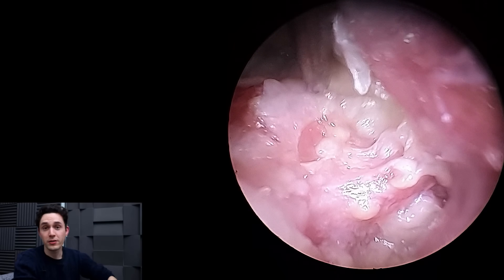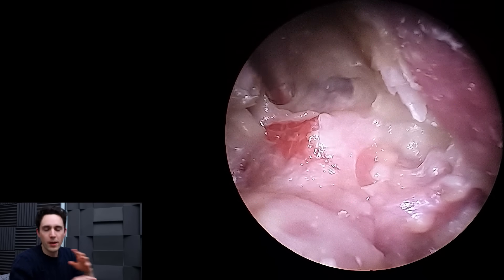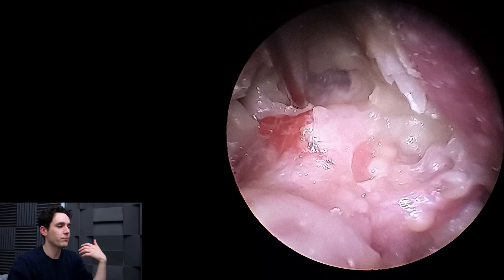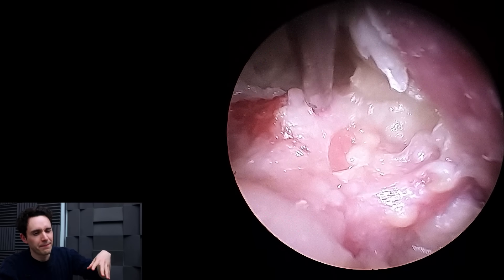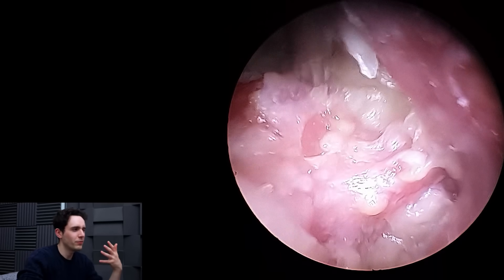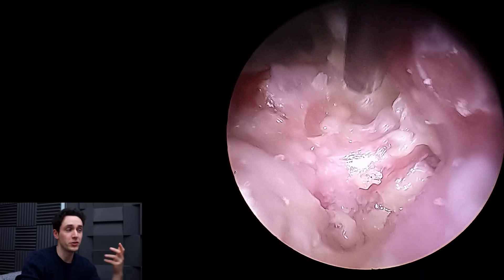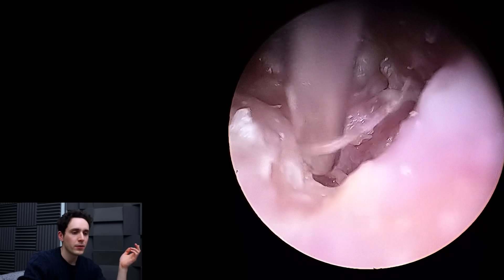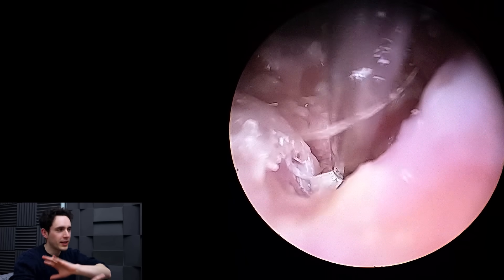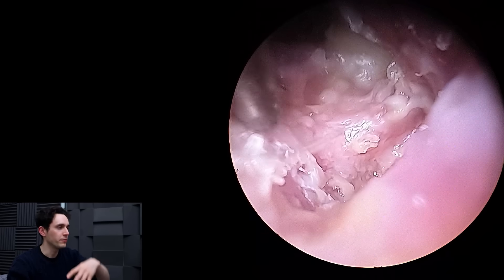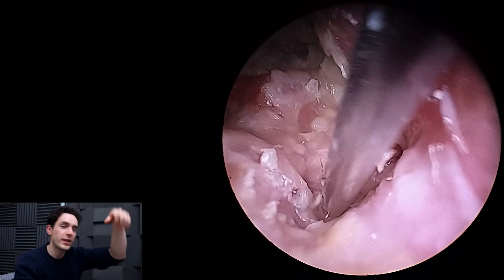I didn't refer him thinking that there would be all these canal cholesteatomas in there. A mastoid obliteration — Vic Veer's done a really good video on this — essentially means you're filling in the space. I know that sounds kind of weird, but if you've got a particularly gnarly cavity like this one which is just getting infected all the time, then what the surgeon would do is try and get rid of this cavity by filling it in — packing the cavity with fat and then swinging some muscle down.